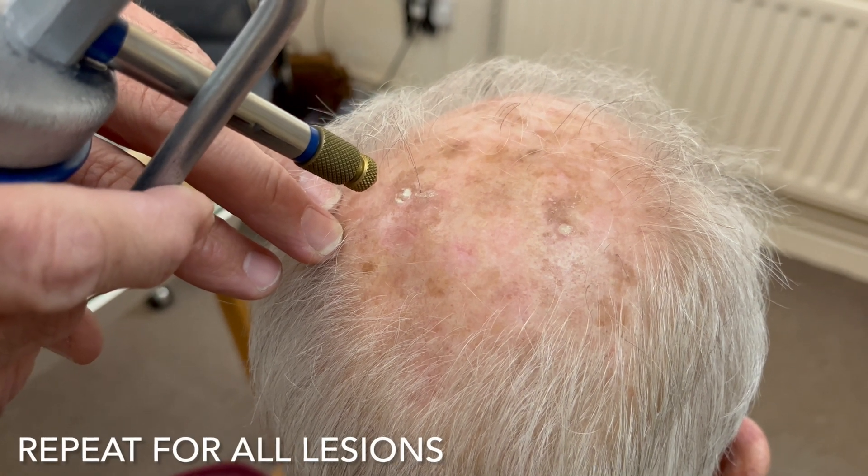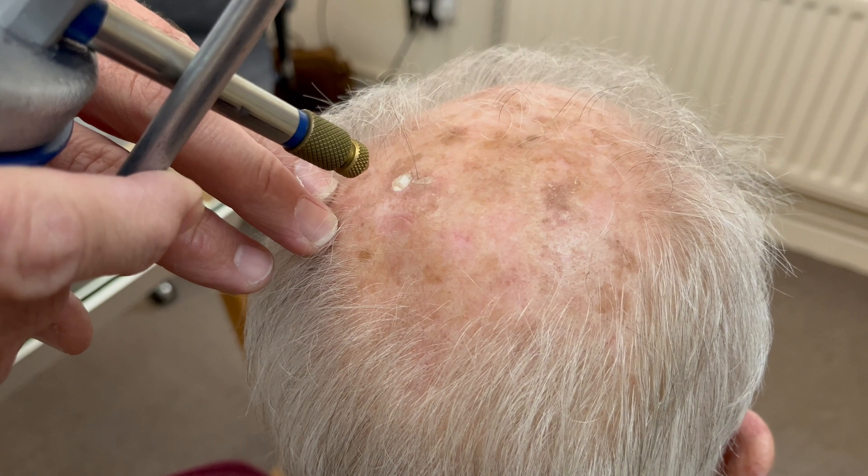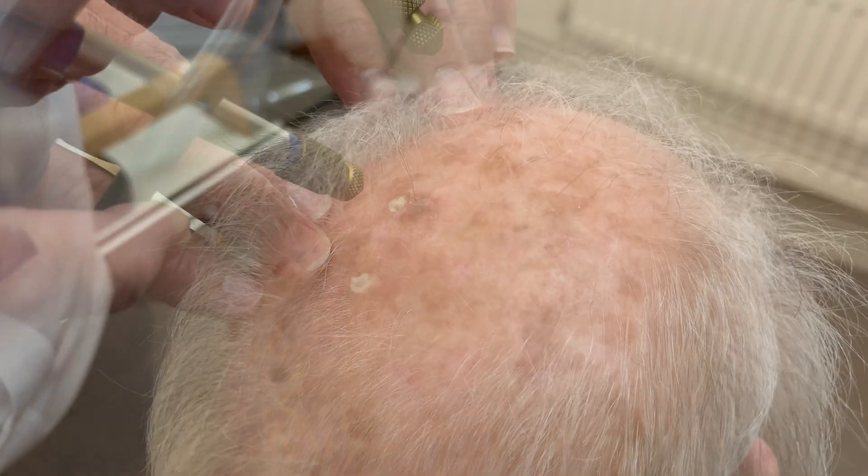This is a further treatment. So again, we're getting the area frozen. And then once it's frozen, we're pulsing the cryogun to make sure it's frozen for that five-second window.